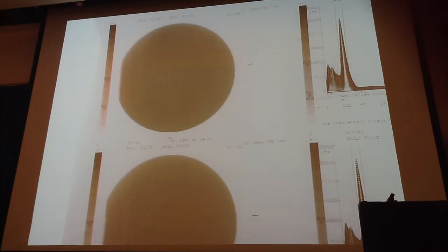Yes. Plus you spill it on the skin. Sympathy points. But the thing is that it is messy, and it took time before you were able to apply enough pressure to squeeze the air out and not all the technetium. Air bubbles in there will create artifacts, so you couldn't do that.